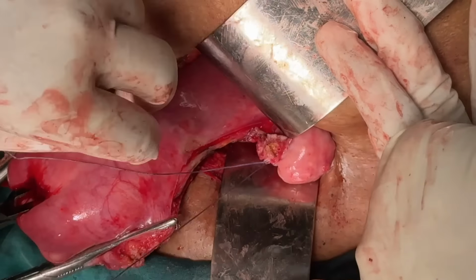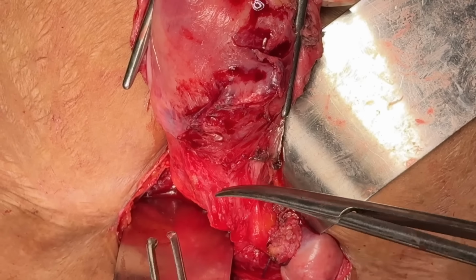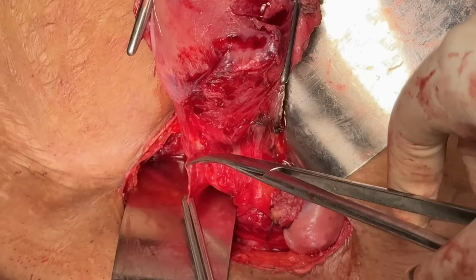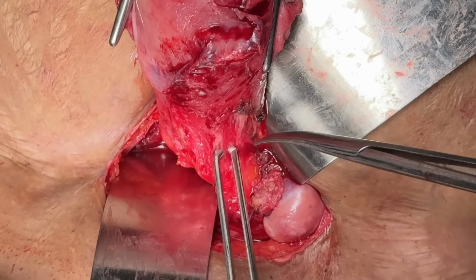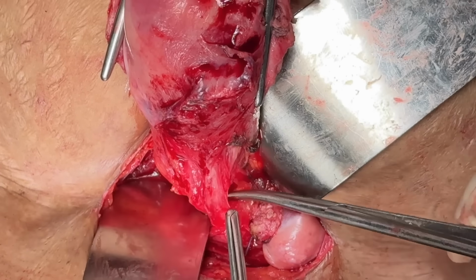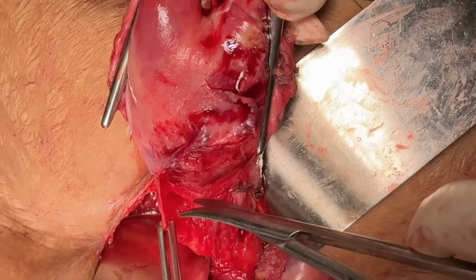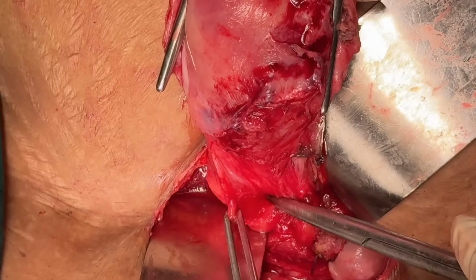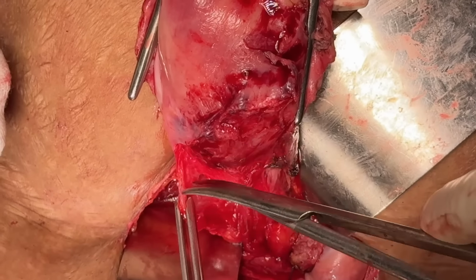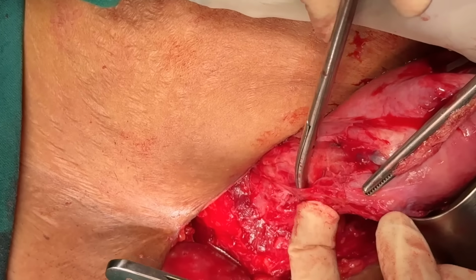So after the cornual structures, tell me what's next. Yes, the next pedicle is the uterine artery. But before clamping and ligating the uterine artery, we must be sure that the bladder has been pushed down and retracted behind the retractor in totality. So we have to do a proper adhesiolysis now.